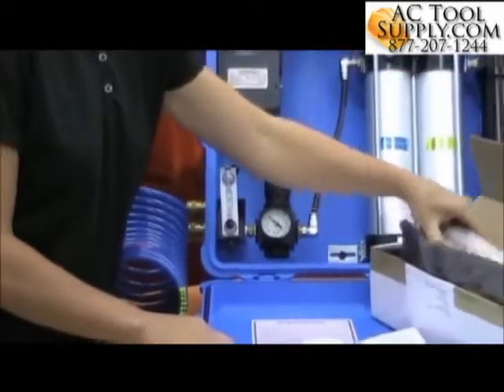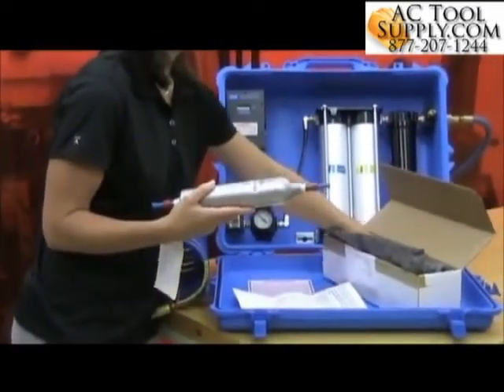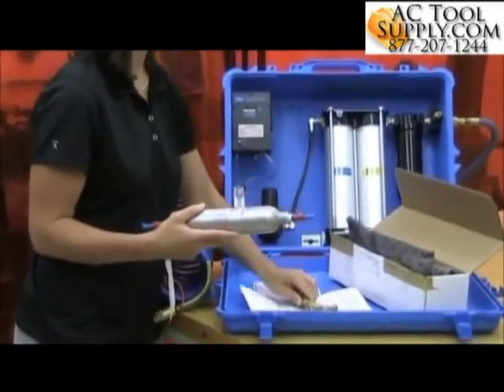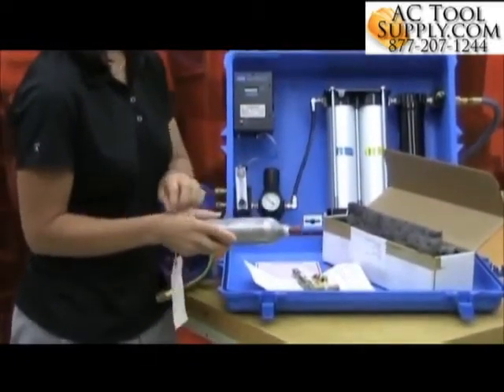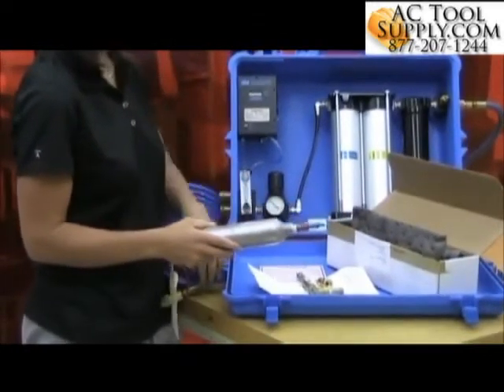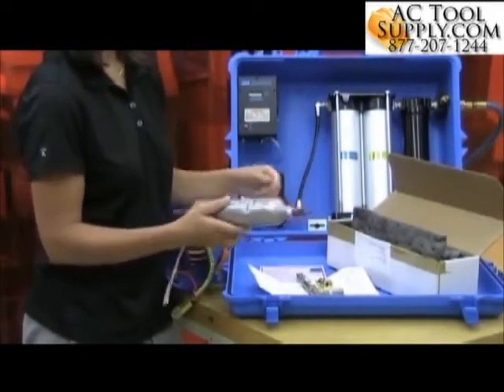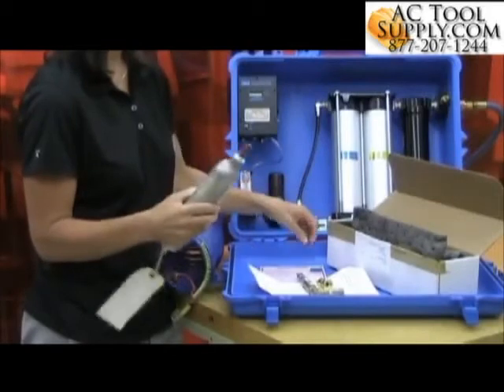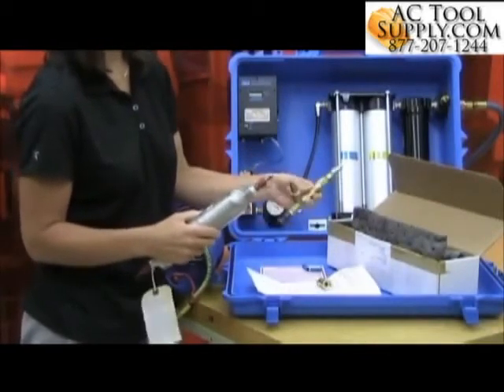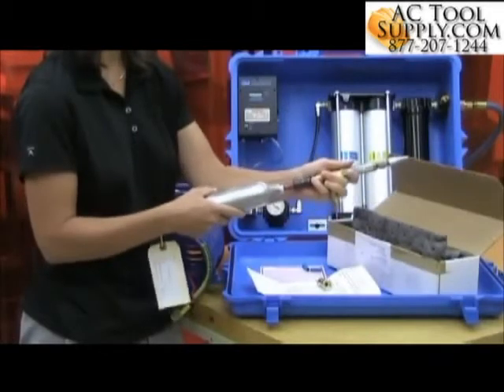In my kit, I've got the evacuated canister and various fittings. You'll need to make sure that you use fittings that are compatible with your particular supplied air system. I'll start by just removing the caps from the evacuated canister and attach the fittings as shown in the user instructions.